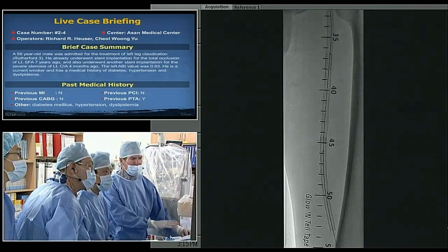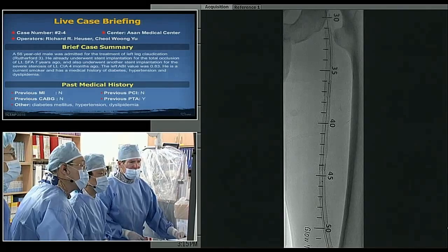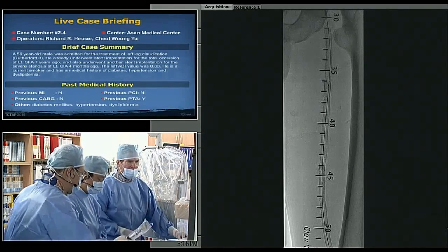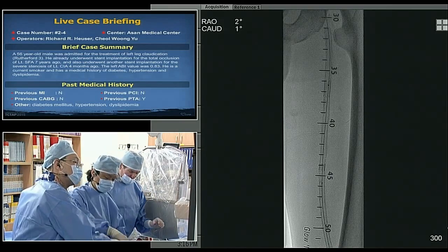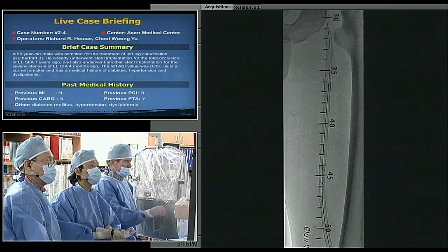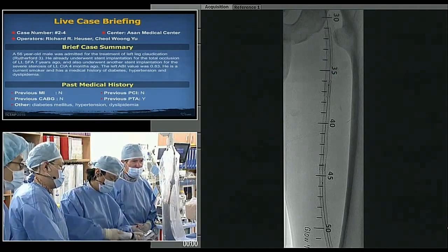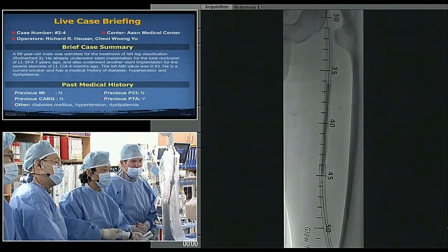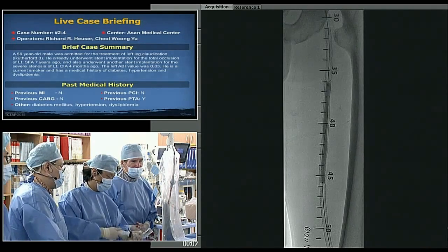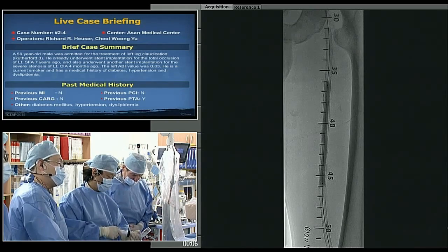Let's see, we're panning back a little bit here. Do we have everything covered? I think we do. Everybody happy with going there? Yep. So we're going to put a third 6 by 120 up after this. As they're doing this balloon, Sensei, if I could ask, the Leipzig experience, Sven, how would you treat this in your lab?